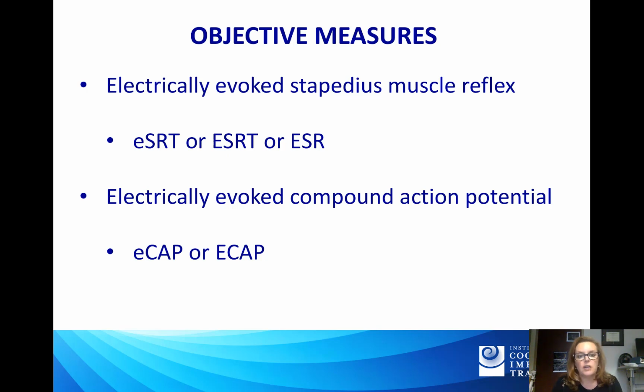And then after that, we'll talk about the ECAP, which is usually referred to as NRT, NRI, ART, which is just really sort of the marketing terms that each of the cochlear implant manufacturers has chosen to use for what really is just an electrically evoked compound action potential.